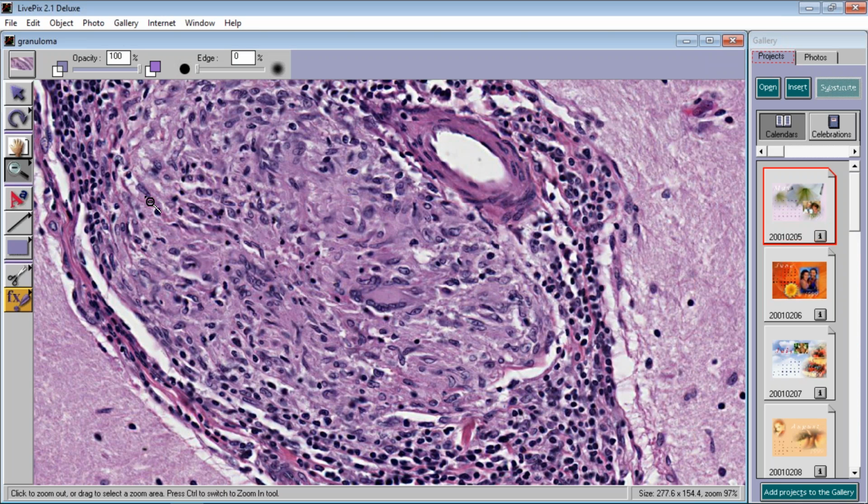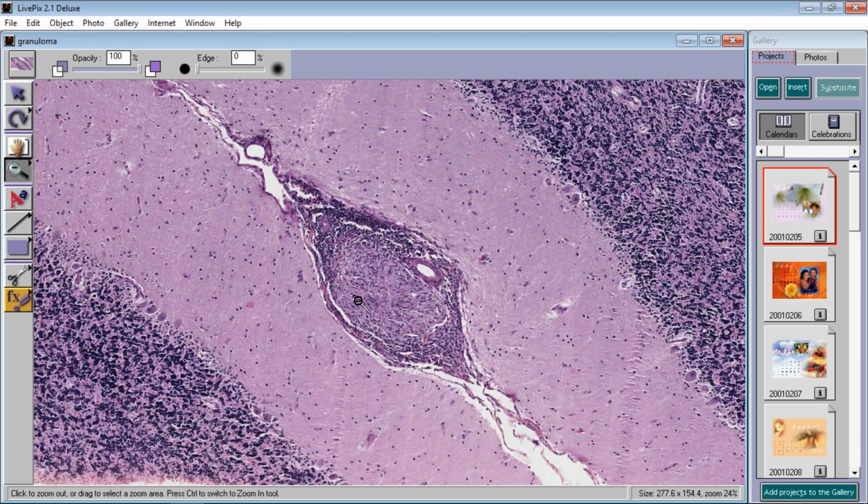Now, I know that the clinical people and the surgeons have been kind of brainwashed into thinking that non-caseating granulomas are not tuberculosis and caseating granulomas are tuberculosis. Well, if you want to think that way, you can, but in all honesty, a non-caseating granuloma could be any granuloma. And this particular non-caseating granuloma is totally typical for sarcoidosis.